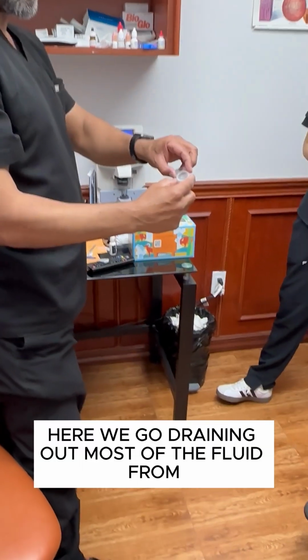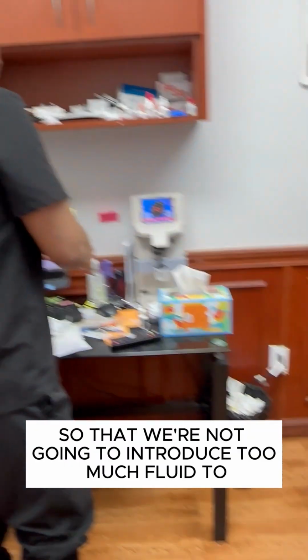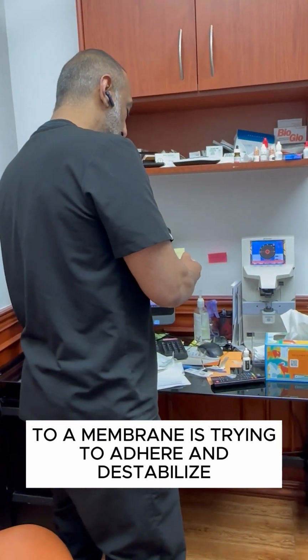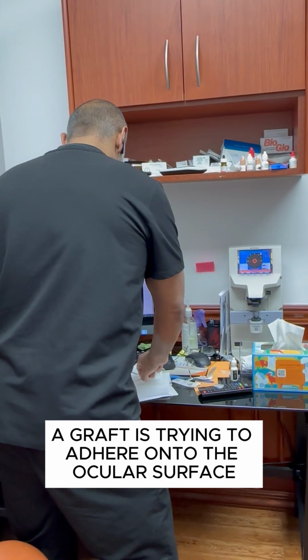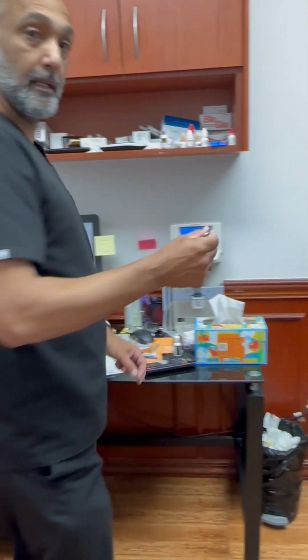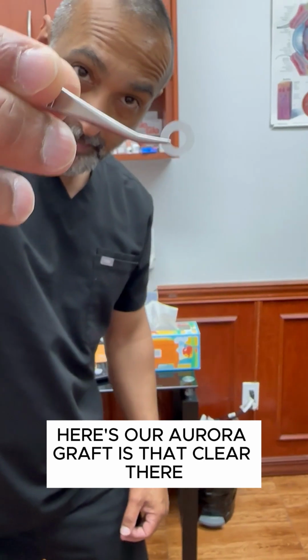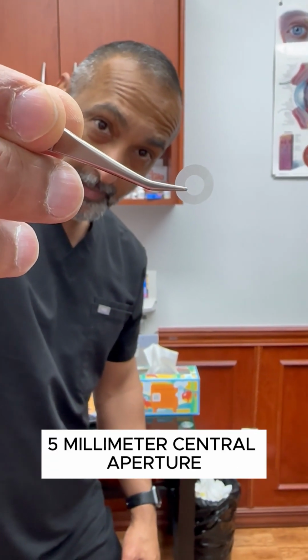Here we go. We're draining out most of the fluid from what would be the bandage lens so that we're not going to introduce too much fluid to a membrane that's trying to adhere and destabilize a graft that's trying to adhere onto the ocular surface. Here's our Aurora graft. Is that clear there? Okay, you can see it's a 10mm in total diameter, 5mm central aperture.